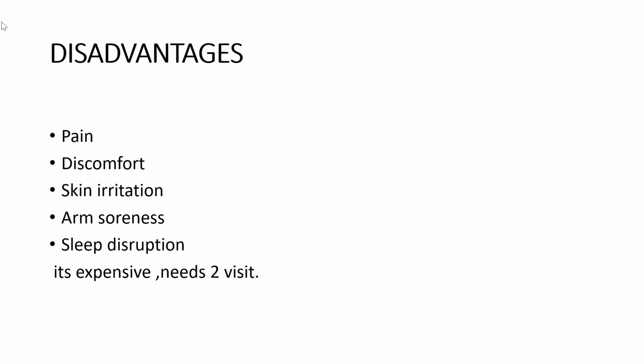Okay, for dippers, it's stated that at night-time there should be a reduction of about 10 to 20% of the daytime blood pressure.